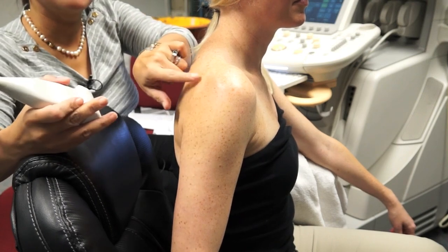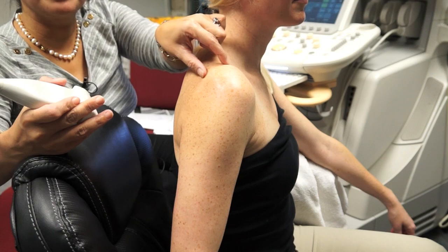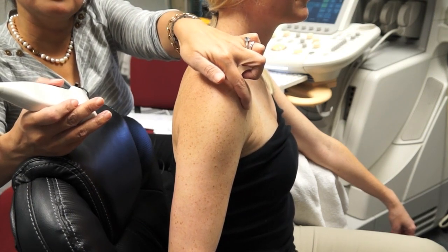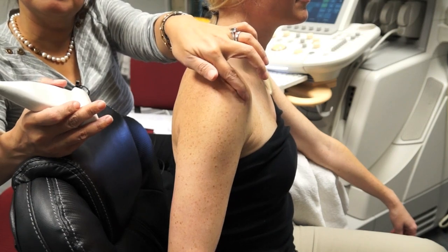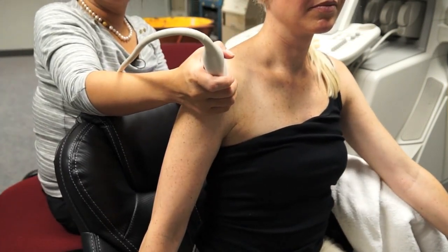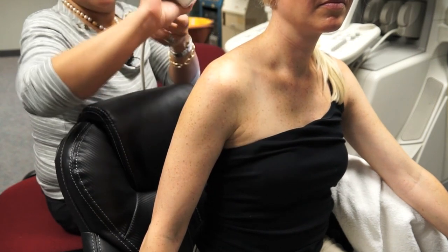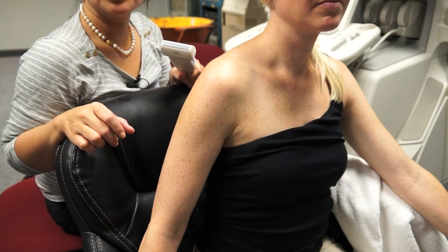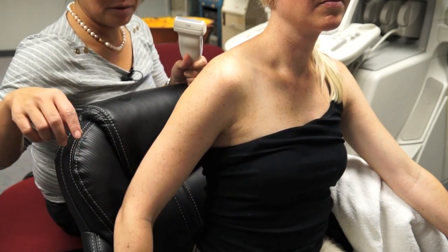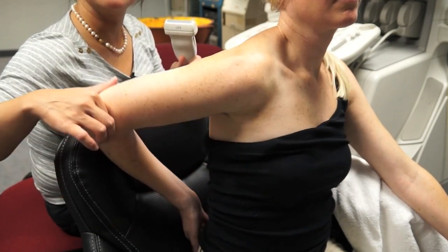I'll show you later. But the supraspinatus sits above the scapular spine and comes down and inserts on the greater tuberosity. So I prefer to scan with the patient facing away from me so that I can put the transducer comfortably to look at that tendon. Second is you can have several positions for your patient. You can have them place their arm behind their back, okay, or have their arm in their back pocket.